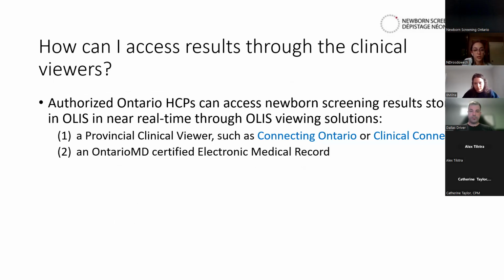So the first viewing option is a provincial clinical viewer, such as Connecting Ontario or Clinical Connect, depending on your region. And the second option is directly through an Ontario MD certified electronic medical record.